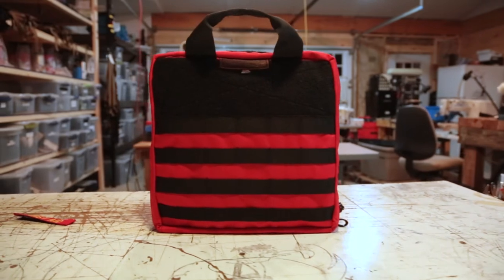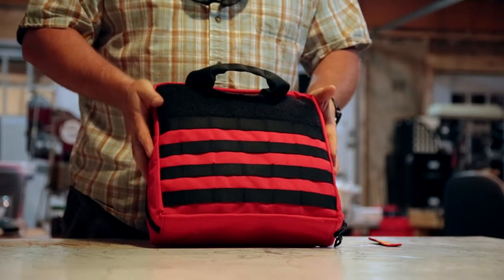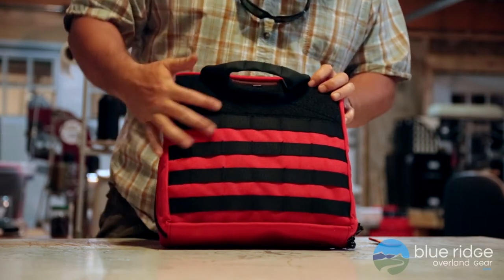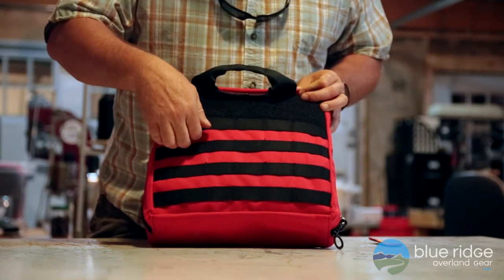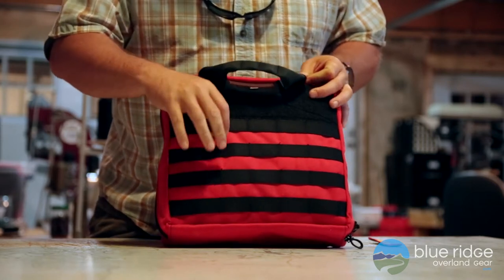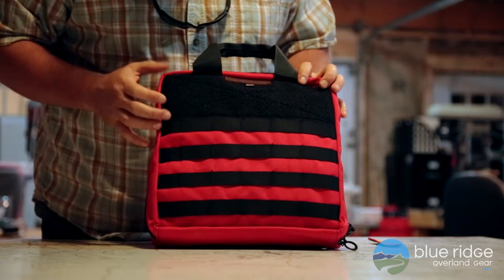Today at the shed we're going to take a look at our first aid kit bag. This is a large first aid kit bag — we make a smaller one as well. We did this one in red. It's got four rows of PALS webbing on it, so you can put general purpose pouches and miscellaneous stuff that is MOLLE compatible.